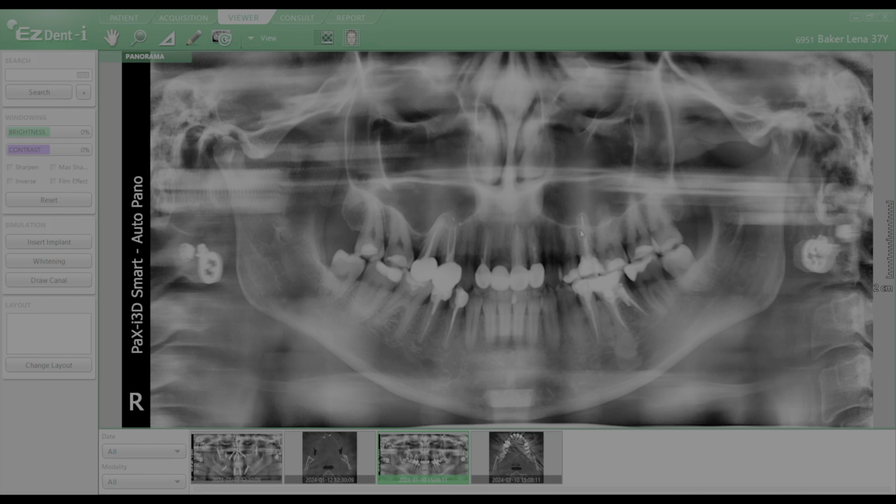So what we did was something called trans-sinus implants, and we were just discussing this in regards to having contingencies. She's 37 years old, right? So to be taking out her teeth and doing all-on-4 to avoid this vicious circle of failing crowns and root canals, and she's investing in something, how are we going to give her a great long-term prognosis?